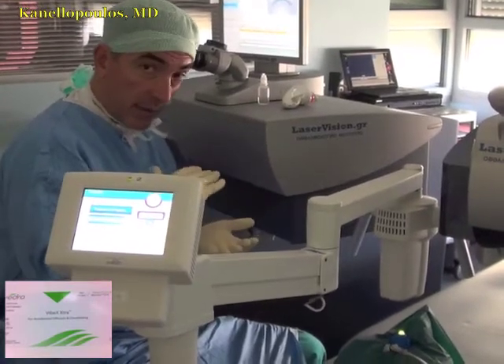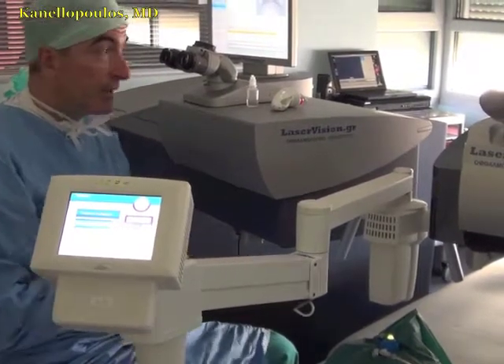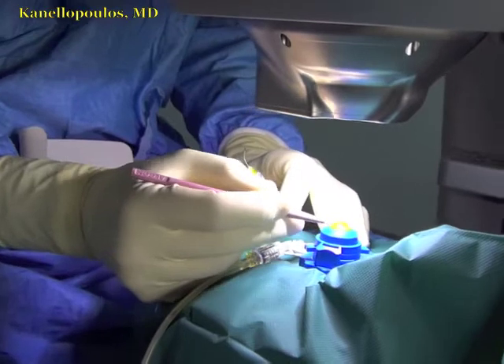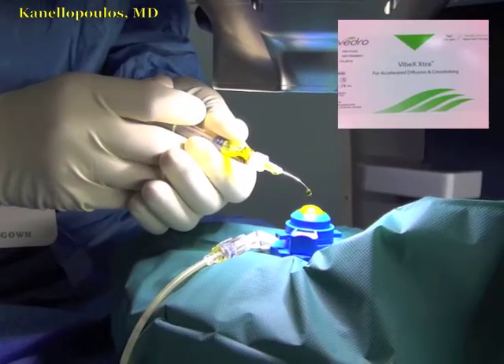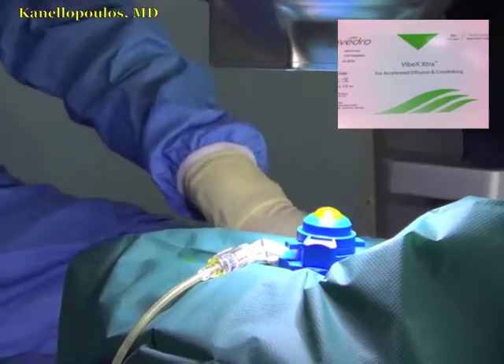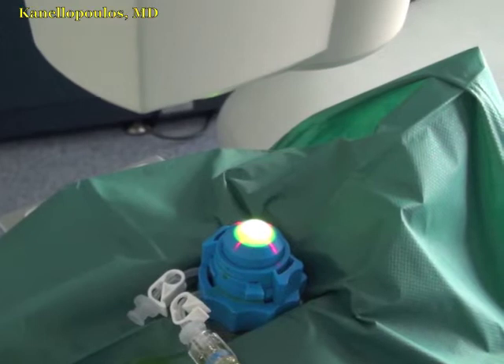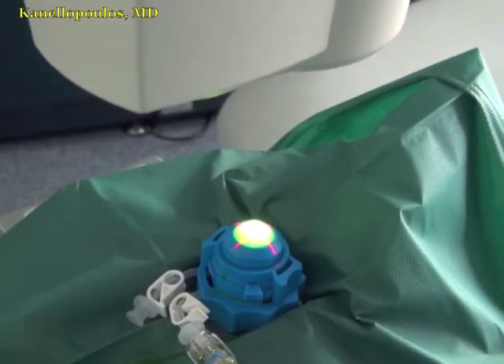Remember, the pocket is at 400 microns. Following this first session of deep collagen cross-linking, I'm scraping the surface of the donor cornea, removing the epithelium, and again applying 10 minutes of Vibex Extra, 0.25% riboflavin by Avedro. Then a very high-fluence second session — 7.2 joules — for this cornea.